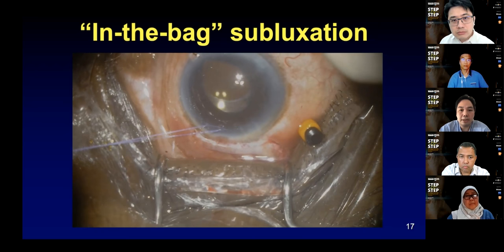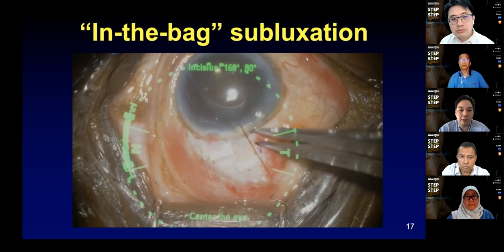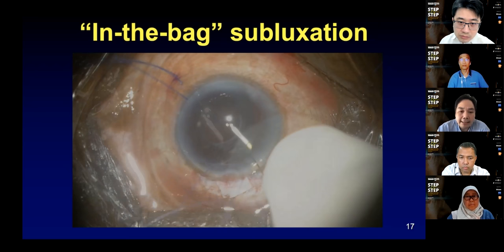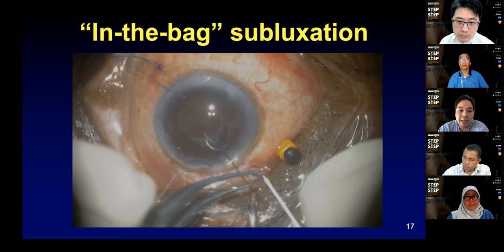Similarly on the other side. The pupil obviously is not well dilated in this pseudoexfoliation patient, so I put in the iris hook so I can see the haptic properly and do the same again. Again, 2.5 millimeters posterior, you go under the haptic, feed in another double-ended Prolene suture, or 6-0 Prolene, and bring it through as before. I repeat the same process to lasso the other side.